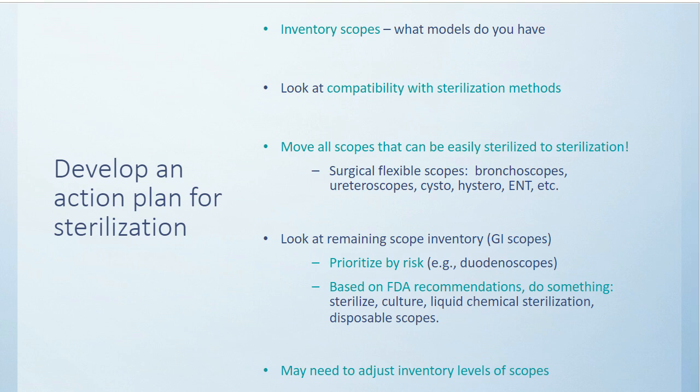Know your inventory. Look at the compatibility of your scopes. Move anything like your bronchs, your ureteroscopes, should already be sterile. We saw a safety alert come out this week on certain urology scopes. Cysto, hystero, ENT, a lot of those can be sterilized, so they should be sterilized.